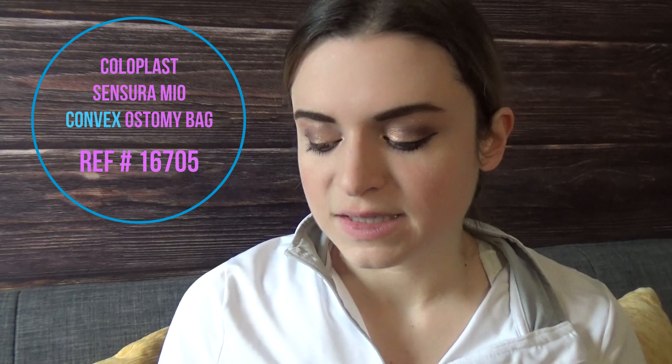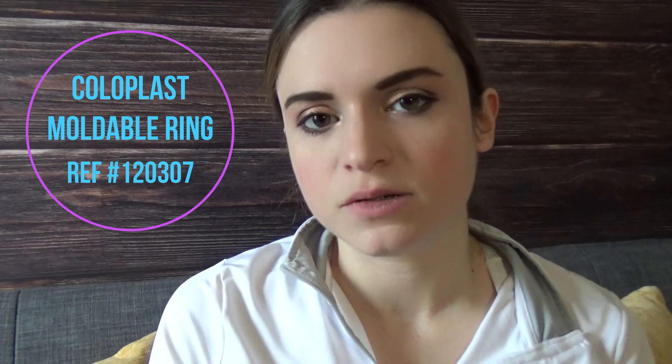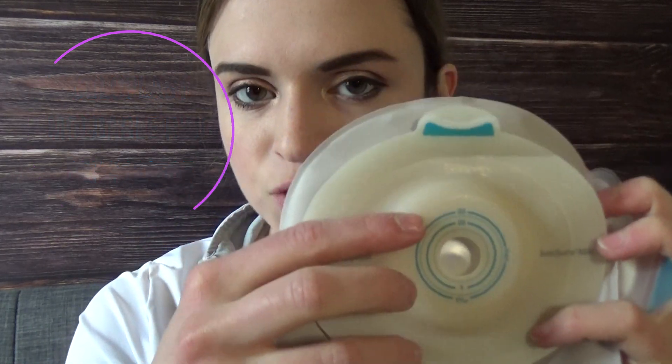The next thing I want to talk about is something that probably all of you use regardless of whether you have a retracted stoma. This is the Coloplast Brava moldable ring — the reference number is 120307. It's really nice. I put it around the hole where my stoma will be fitting through, and I'll show you that in a clip where I put on the bag.